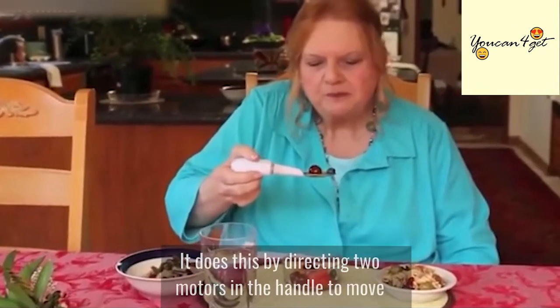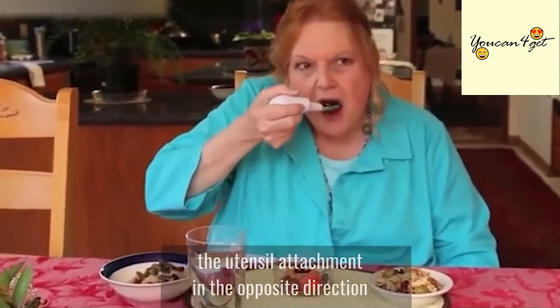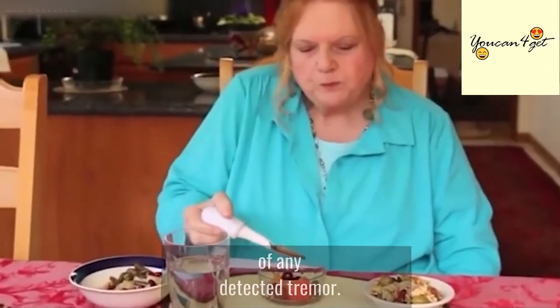It does this by directing two motors in the handle to move the utensil attachment in the opposite direction of any detected tremor.